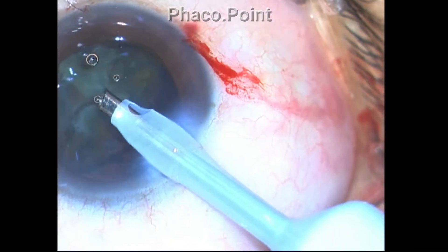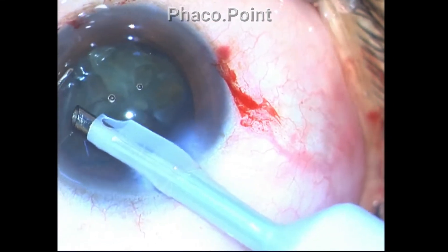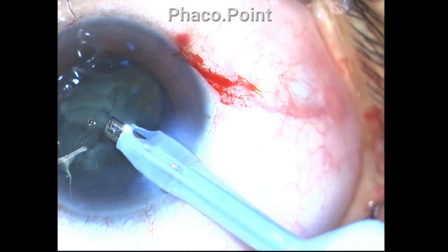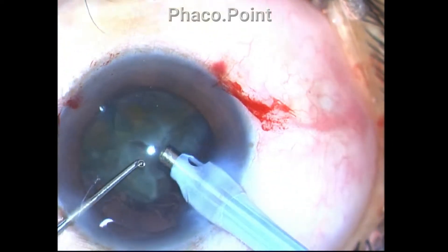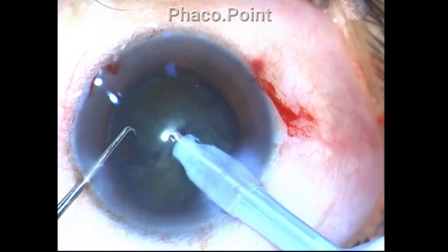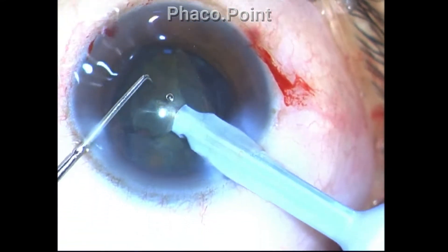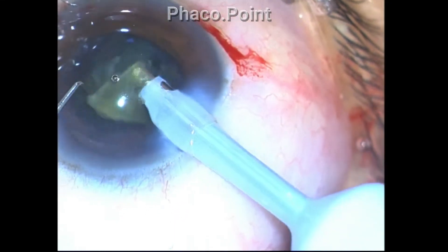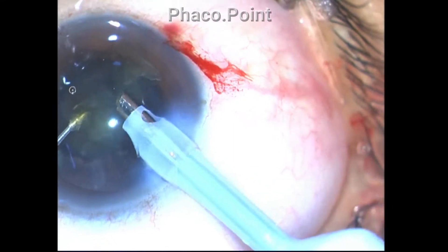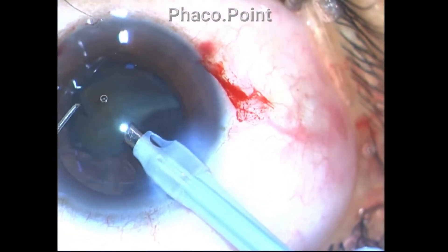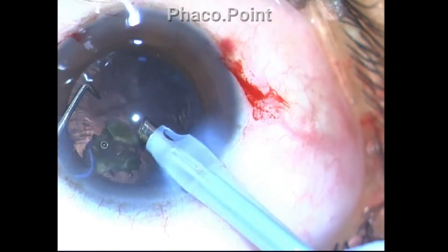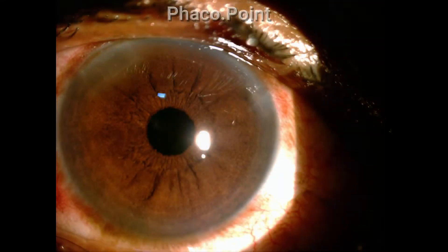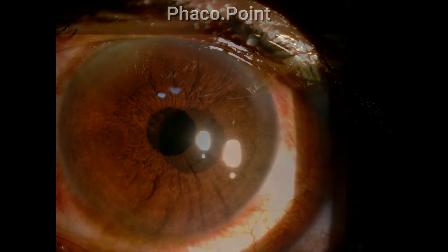A small capsulorrhexis helps keep the nucleus mass inside the capsular bag and well away from the corneal endothelium. During the entire procedure, the small fragments that are created are fully emulsified and completely removed before I address the next fragment. While the second fragment tends to come up, my second instrument pushes it back into the capsular bag, and only after finishing the previous fragment do I address the next one. This is how the patient's cornea looked on the first post-operative day — crystal clear, just by a simple modification of technique.